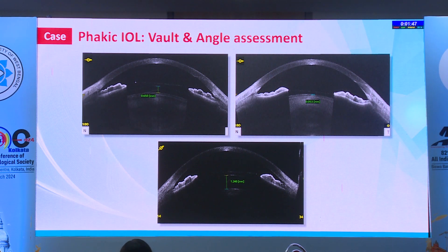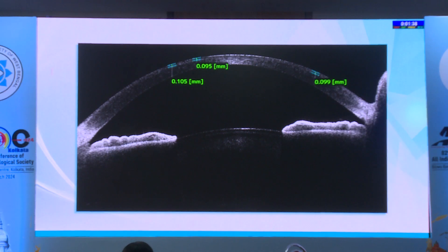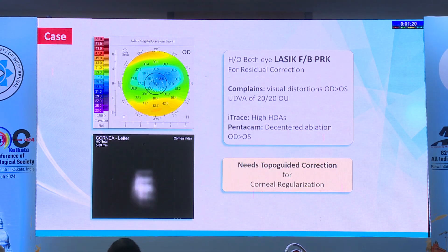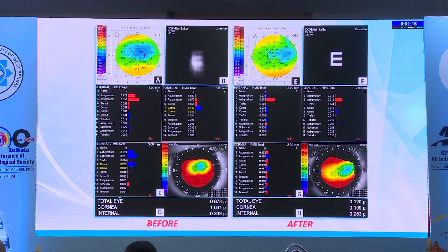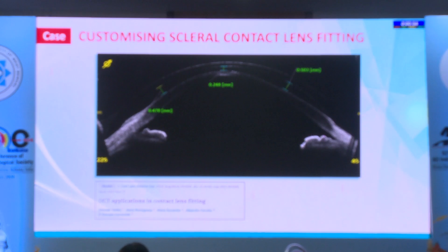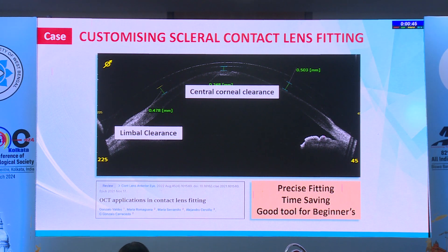ASOCT also helps in phakic IOL monitoring and vault assessment, and in assessing the epithelial map. This was a case of a patient operated overseas who had LASIK done, then a PRK — we had no history of why the PRK was done, but the patient said there was residual power and PRK was performed. He was again complaining of disturbed vision and we saw a simulated image with a lot of aberrations. We did not know if flap lifting could be redone. The ASOCT helped us assess the epithelial thickness, and since the epithelium was fine, we could relift the flap and do a topo-guided treatment — the patient improved significantly. It also helps in customizing scleral contact lens fittings for beginners, reducing time and enabling precise fitting.